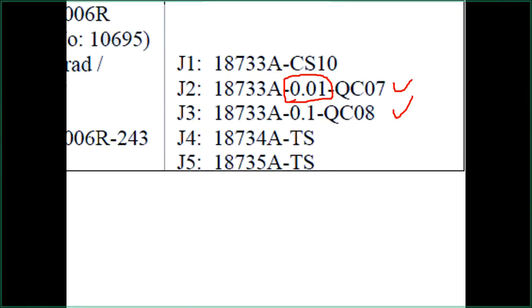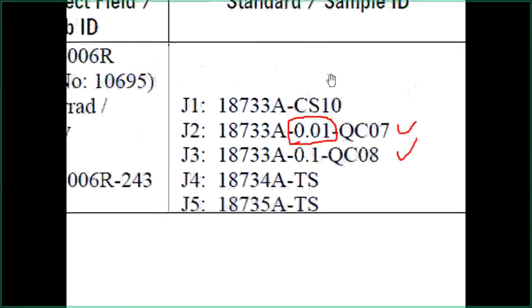In EPA, GLP EPA work, basically you can pick any spike you want. But I think in the EU you must spike the lower one. Even in Canada, unless you have a reason, you must do this one as well. So it depends on where you follow. It's not necessarily GLP, it's the country requirement, the registration requirement. Sometimes it's residue driven. So if the residue is low, you always need to have a low spike. So that's called a set. That's the definition of a set.